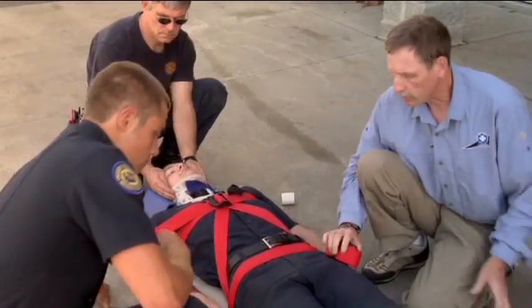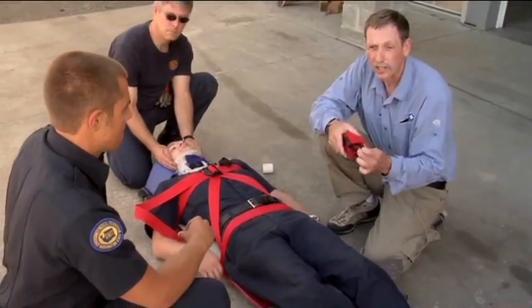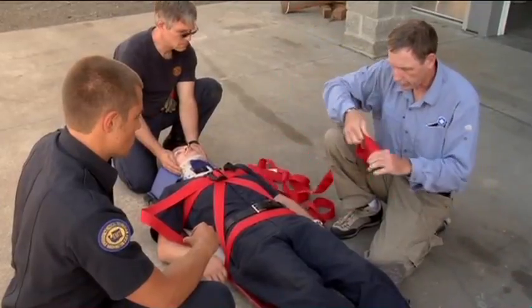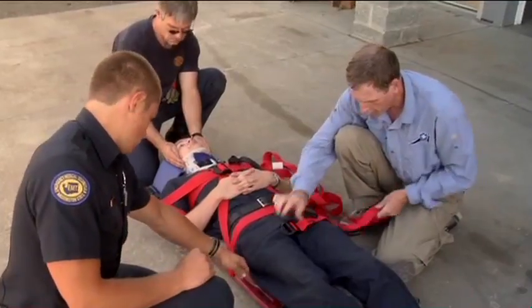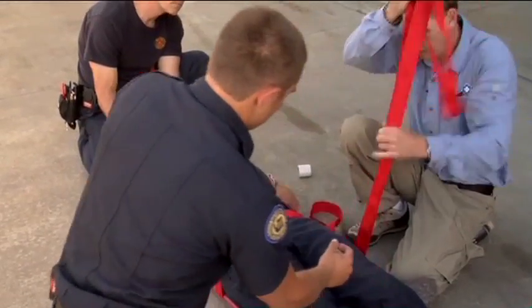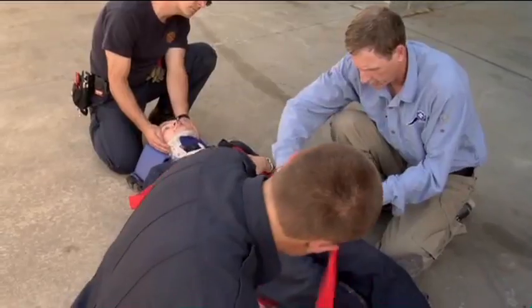Now we're going to do a similar thing here from the lower pelvis down, except we're not going to use deceleration straps. I'm going to find a spot, low pelvis, right about here maybe, and I'm going to go ahead and thread it through. And then Chris is going to find a spot down by the feet someplace.